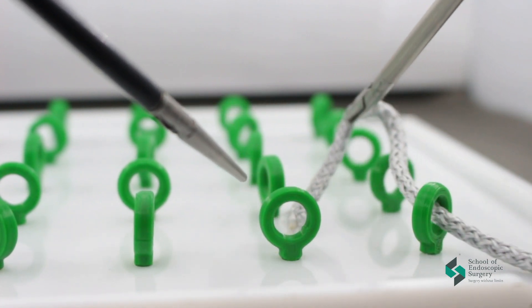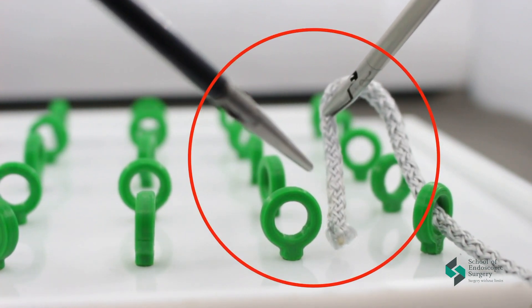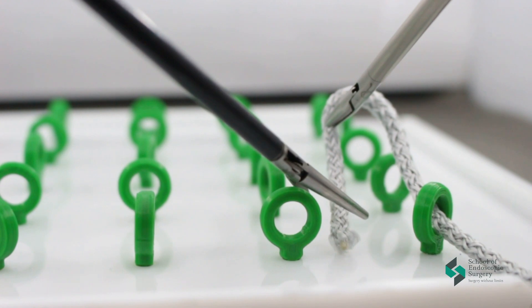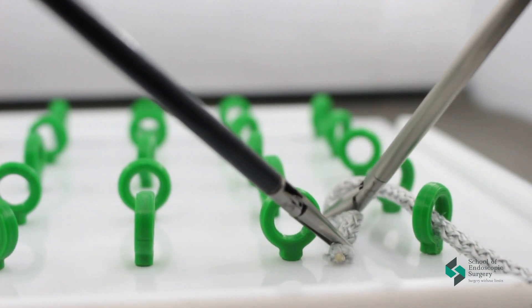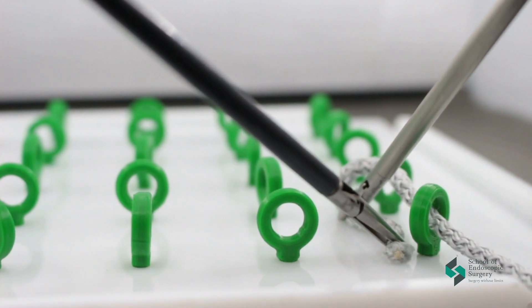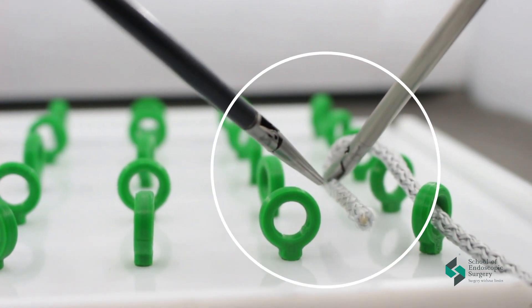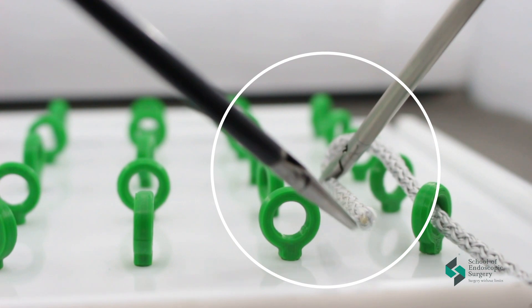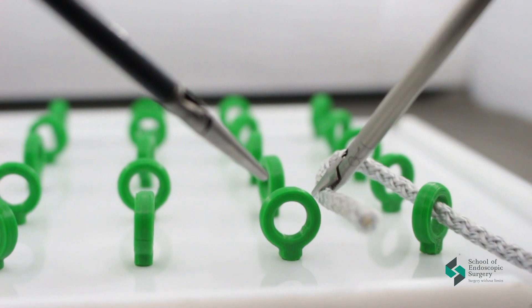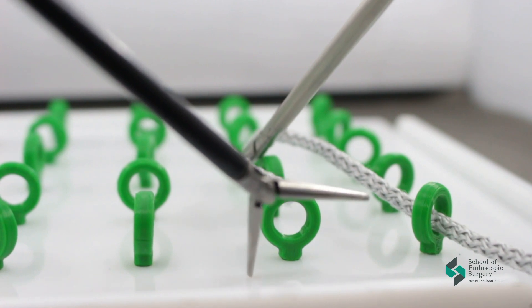Always grab the thread with the end of the tip. Try to imitate the course of the thread and try to do it slowly.